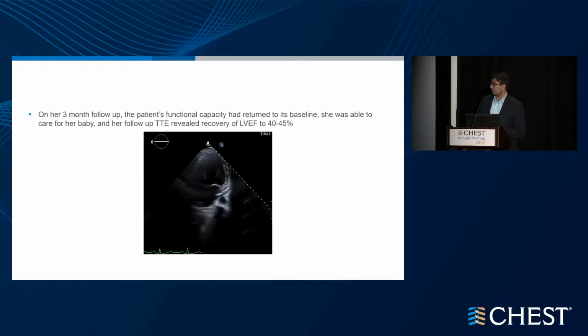So this is her echo at her 3-month follow-up appointment, in which we see a pretty good response of her left ventricle afterwards. Visually estimated at about 40 to 45%, but she was able to return to her baseline. She's taking care of her baby now, and she's on her path to recovery.